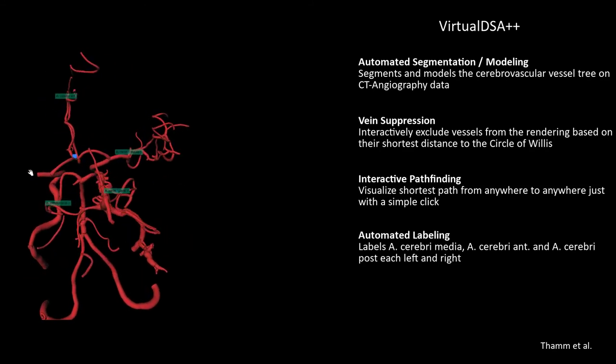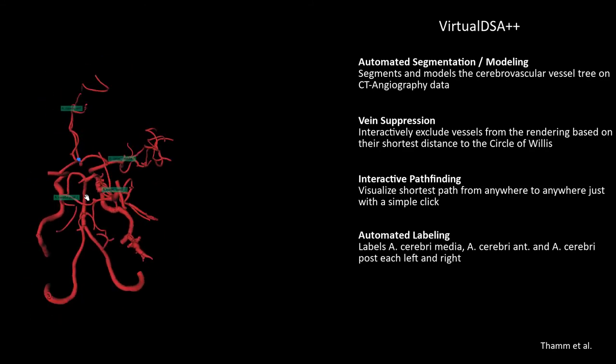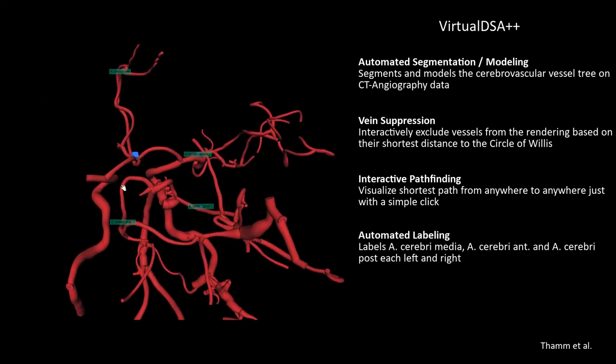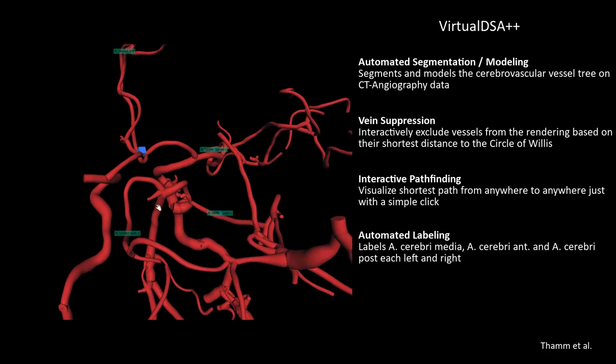It also automatically labels the cerebral arteries: media left and right, posterior left and right, and anterior.